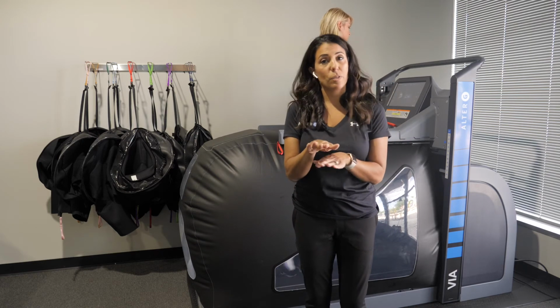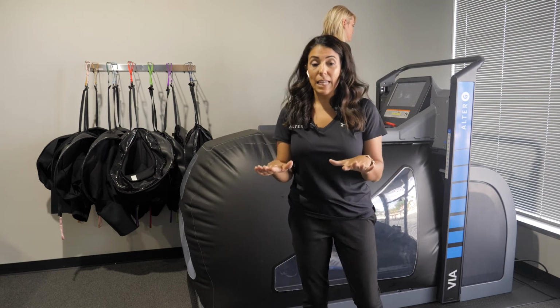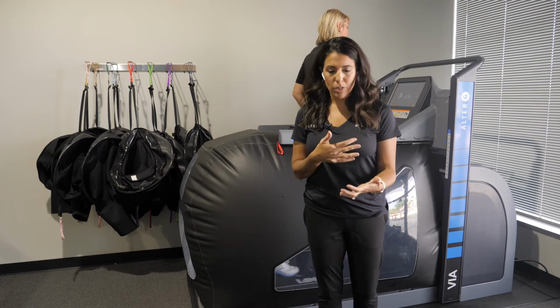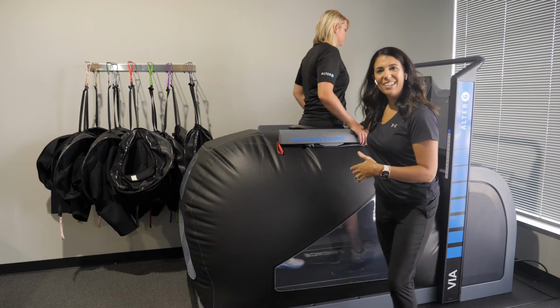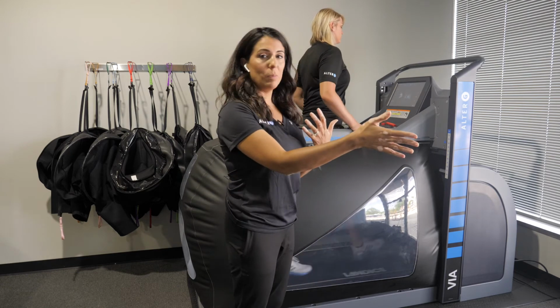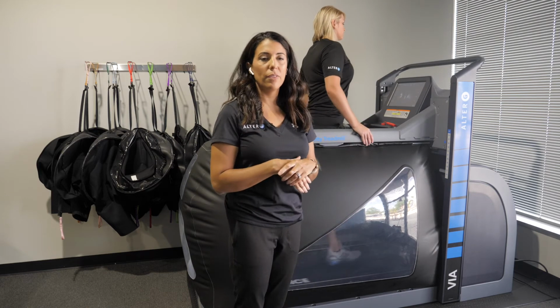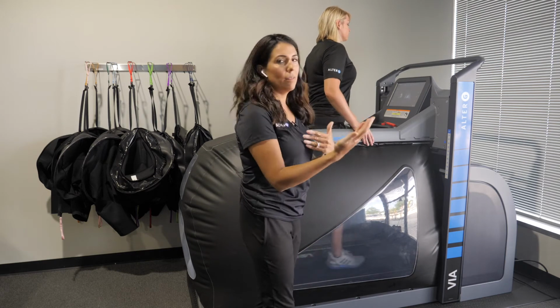Maybe their base of support is very narrow. Maybe you want them to take a little bit wider stance. Really, it depends on what you're working on with your patient, but that visual feedback is a great way for them to start to see how they're walking. Since it's a little bit hard to look down, it also encourages a nice upright trunk and posture, since they're going to be looking at the screen and not down at their feet. So again, just pressing video on the screen allows you to open up the camera and see the patient walking.